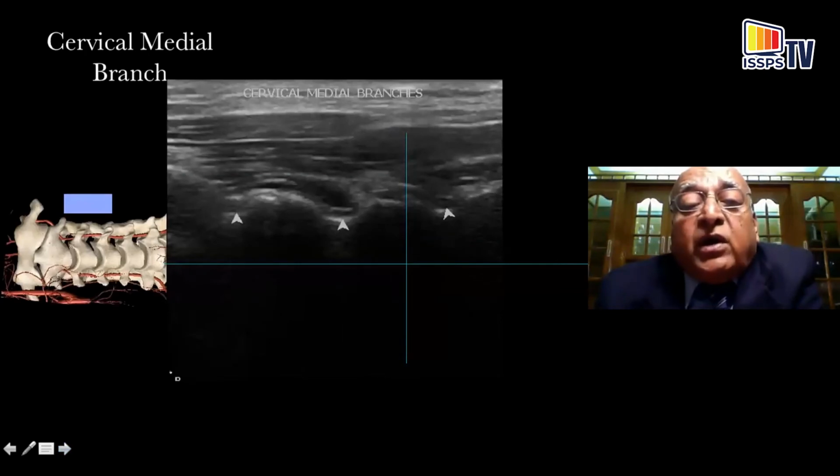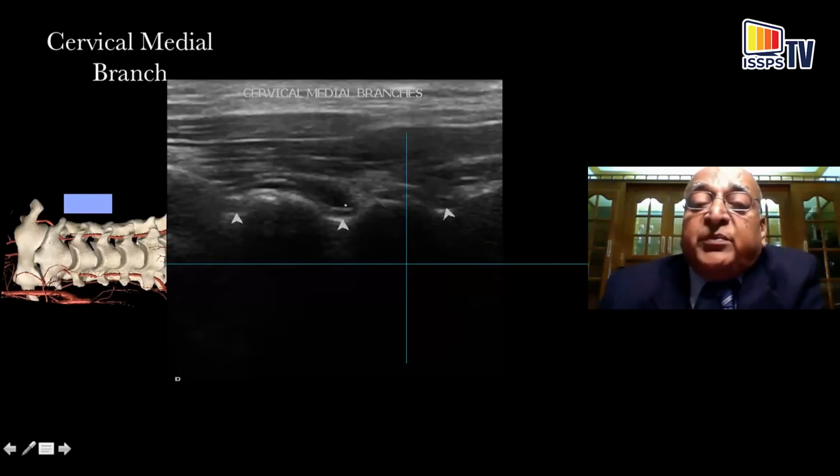And moving on, you will also be able to identify the medial branches, which will be in the valley of the structure. The top of the hillock would be your facet joint, and the medial branch would be located right here. I would encourage you to mark them before you actually do the injection, because these joint lines will look very similar at multiple levels.